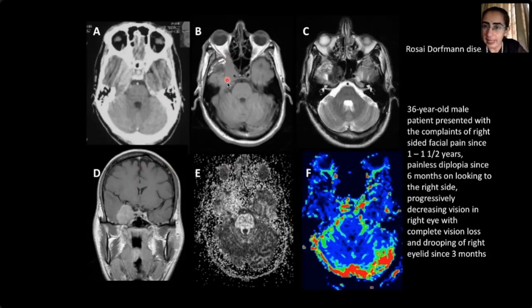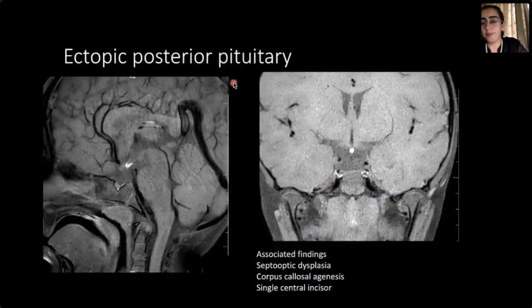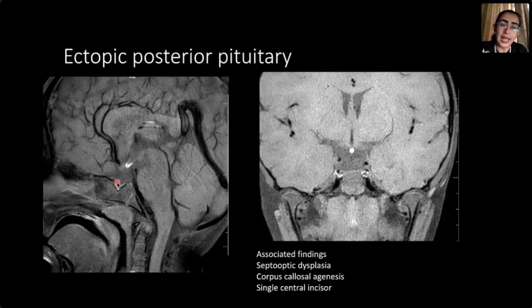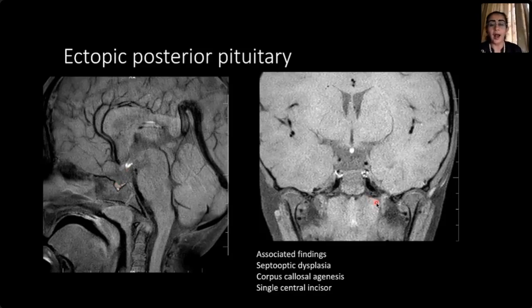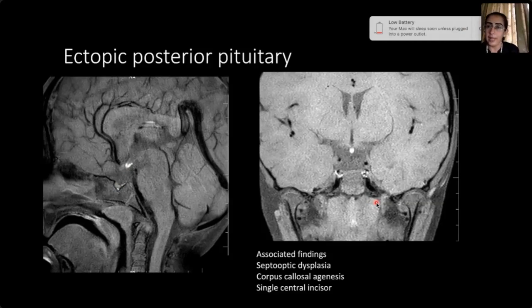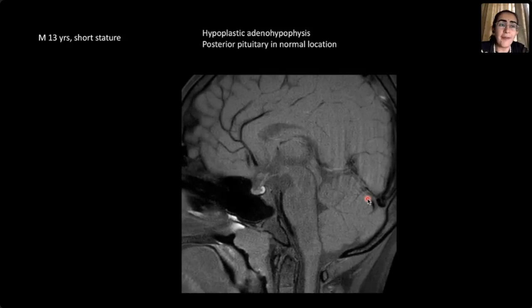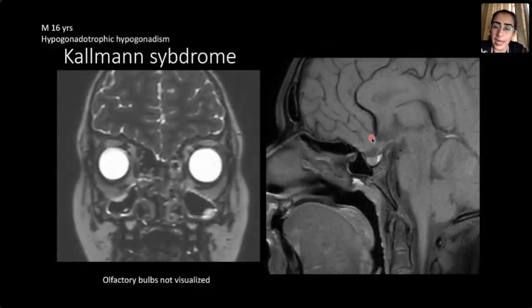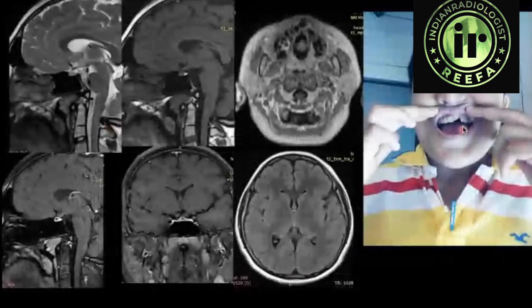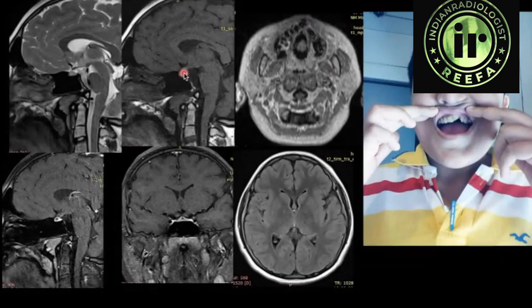In children with short stature, we look for an ectopic posterior pituitary. Normally the posterior pituitary lies behind the adenohypophysis; if it is ectopic and the anterior pituitary is also hypoplastic, this is a common imaging finding. Other associated findings include septo-optic dysplasia, corpus callosal agenesis, or a single central incisor. In a patient with hypogonadotropic hypogonadism where the olfactory bulbs are not visualized, this is Kallmann syndrome. A patient with a single central incisor also had a small anterior pituitary with a tiny cyst, and a hypoplastic clivus.